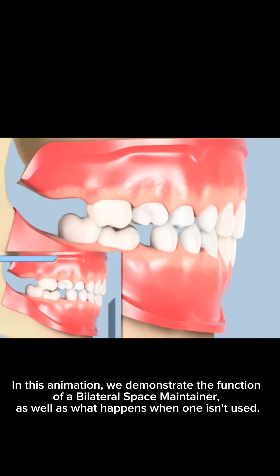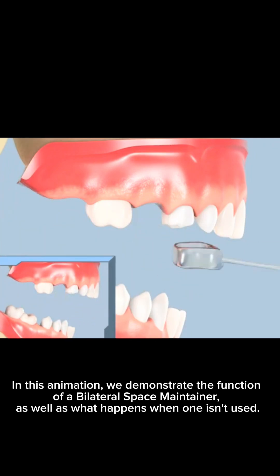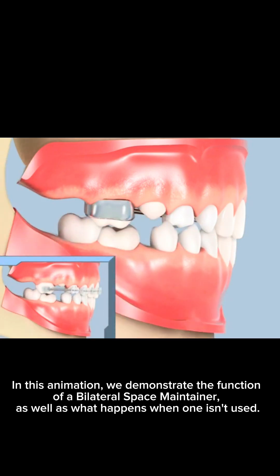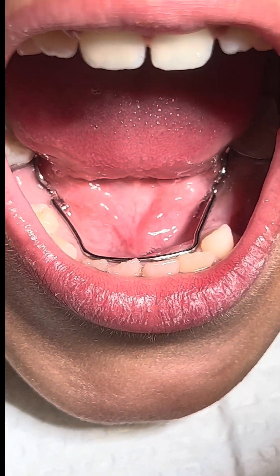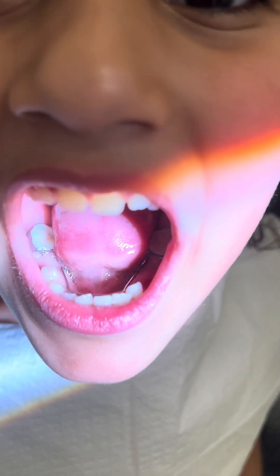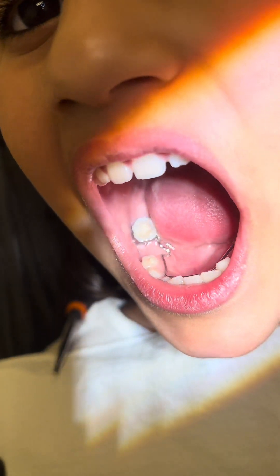In this animation we demonstrate the function of a bilateral space maintainer, as well as what happens when one isn't used. While almost all of our space maintainer designs are easy to clean, your child must have above-average oral hygiene. Space maintainers will catch extra food debris and plaque, so your child will have to make an extra effort in brushing and flossing to maintain healthy teeth.